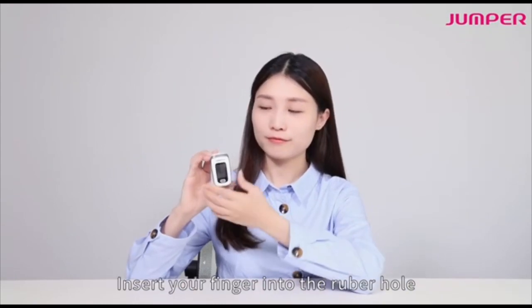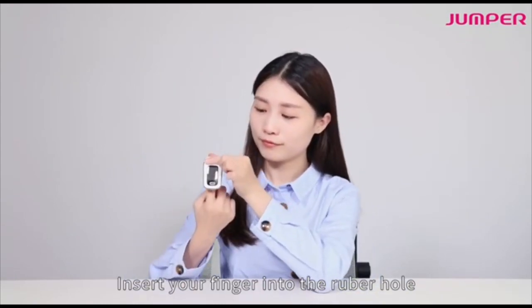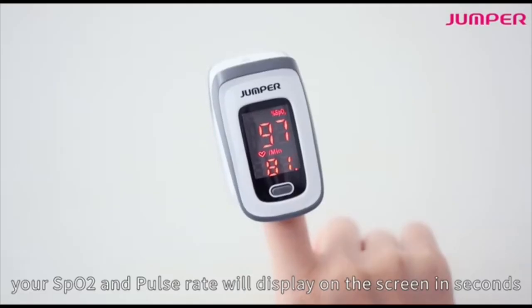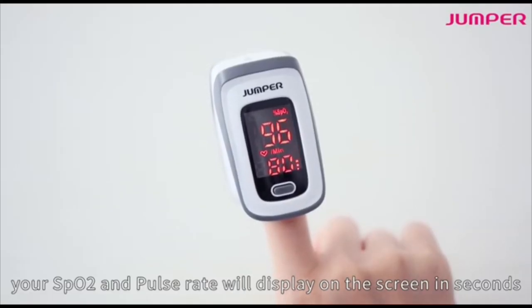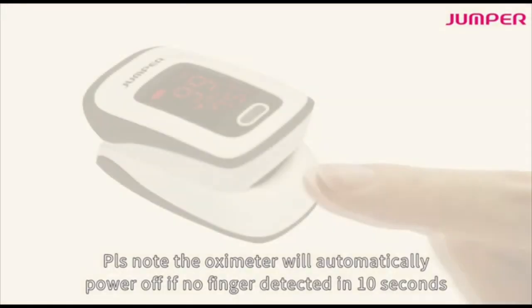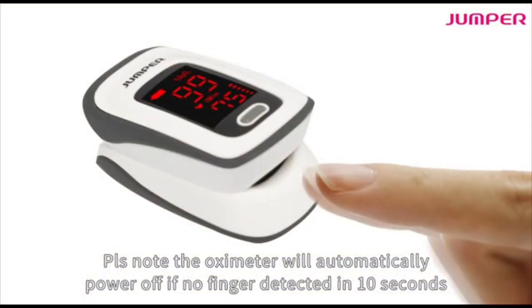Insert your finger into the rubber hole and press the power on button. Your SpO2 and pulse rate will display on the screen in seconds. Please note that the oximeter will automatically power off if no finger is detected within 10 seconds.